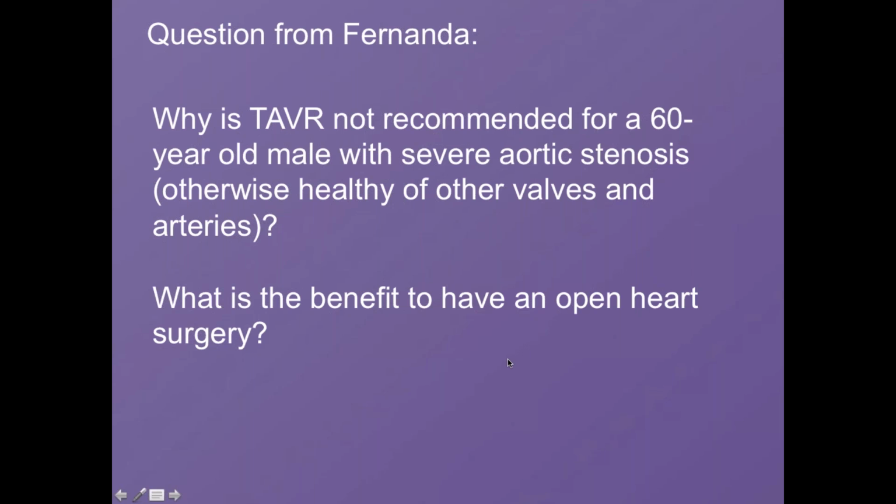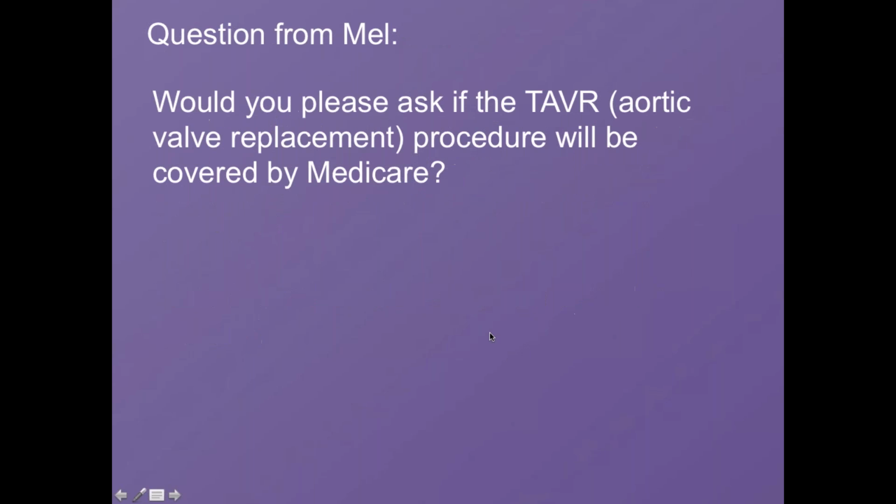Great, and let's keep moving. We've got time for about one or two more questions. We've got a lot of them here. Here comes a question from Mel, which is, would you please ask if the TAVR procedure will be covered by Medicare? Well, there is some good news here, and that is that CMS, Medicare, does cover TAVR procedures, both the commercially approved indications and also the ones that are involved in clinical trials. So this low-risk population right now is being covered by CMS or Medicare, and obviously patients with intermediate or high risk are also covered. And the same thing is true for the MitraClip procedure. So any investigational IDE trial that we talked about, the TriAlign one being another one, would also be covered by Medicare as well.